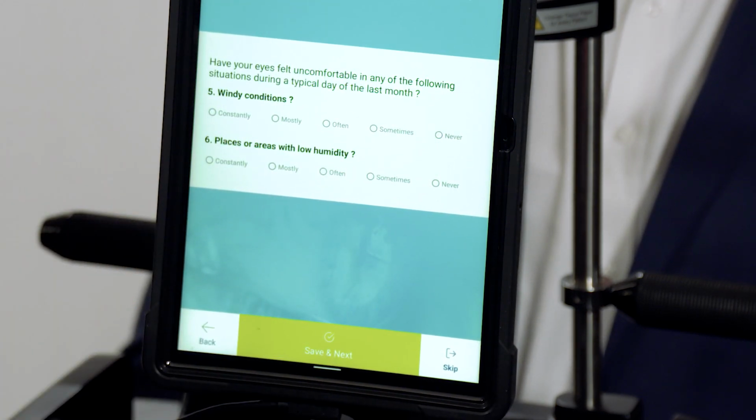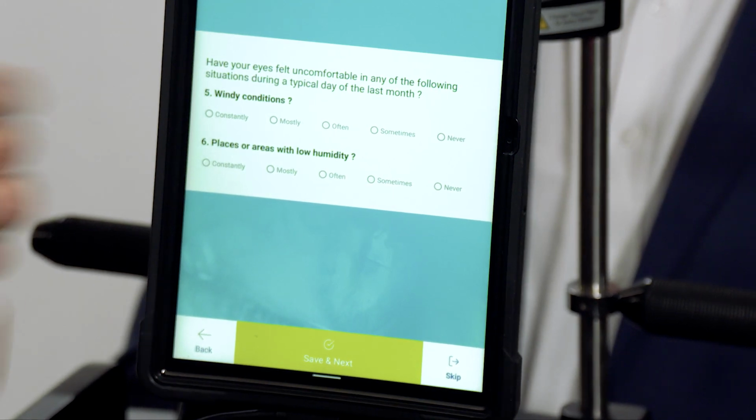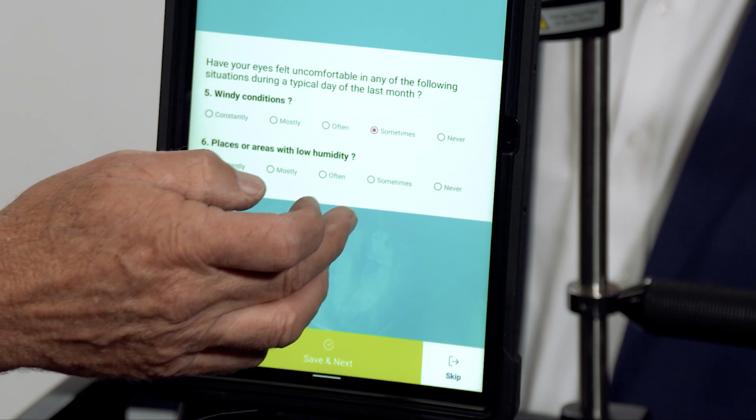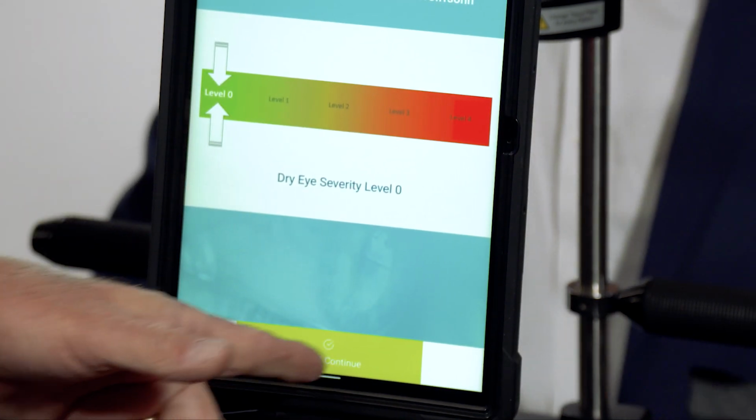Have your eyes felt uncomfortable in any of the following situations or conditions during a typical day in the last month? Windy conditions? Sometimes. Or places of low humidity? Never. Okay, those are our 6 questions. We hit save and proceed.